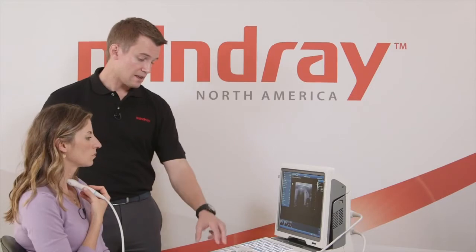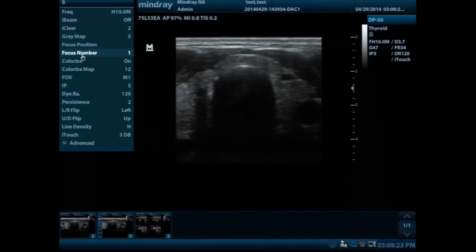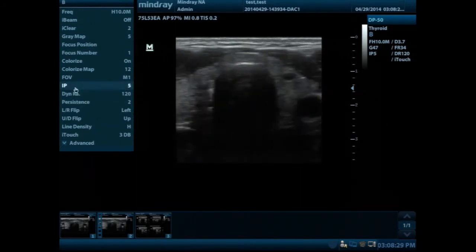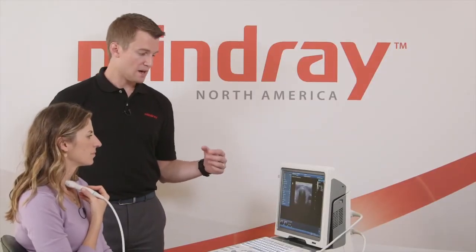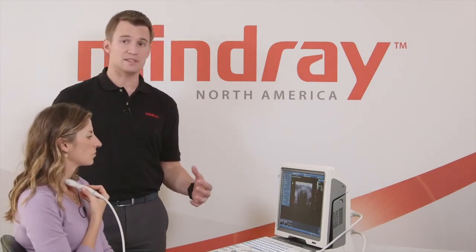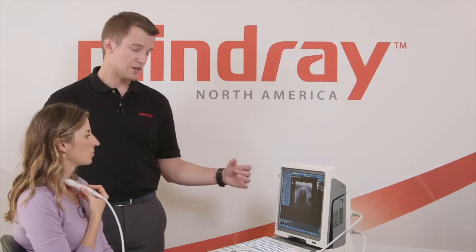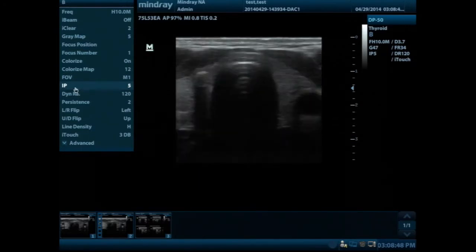So when you're scanning, it's good to play with the gray maps and maybe the dynamic range, which will change the level of brightness. Grays. So if you have a low dynamic range, it's really grainy and crisp and bright. Whereas if you take the dynamic range higher, what you'll find is it's a more smoothed out, lots of gray and things like that. So each exam preset will be set to a different dynamic range, as well as preset and gray maps. And those are things that you just want to manipulate and see what you prefer as you're looking at those.